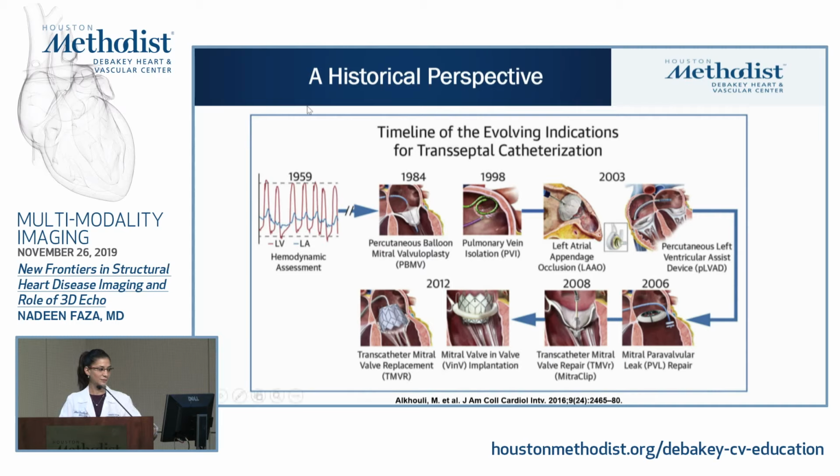Historical perspective, transseptal procedures have been performed since the 1950s, initially to measure hemodynamic LA pressures, especially in patients with mitral stenosis. This was followed by percutaneous balloon mitral valvuloplasties in 1984, followed by pulmonary vein isolation for AFib in the 1990s, followed by left atrial appendage occlusions, percutaneous left ventricular assist devices, PVL closure, mitral clip or percutaneous mitral valve repair, and most recently, mitral valve-in-valve implantations and transcatheter mitral valve replacement.